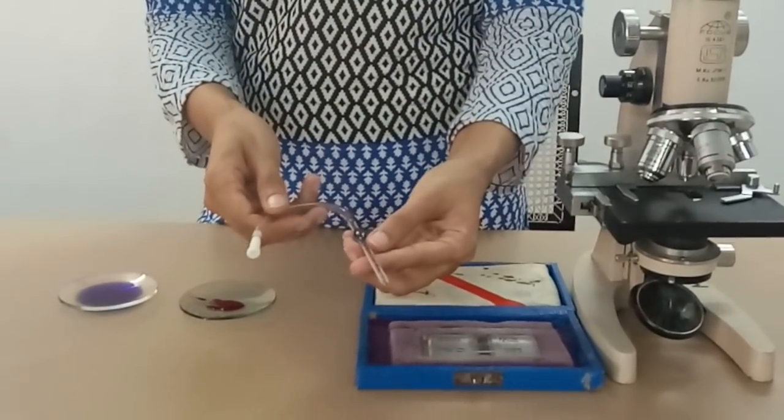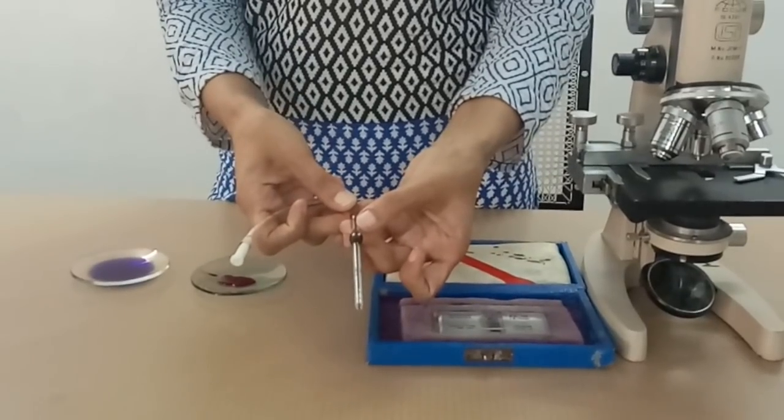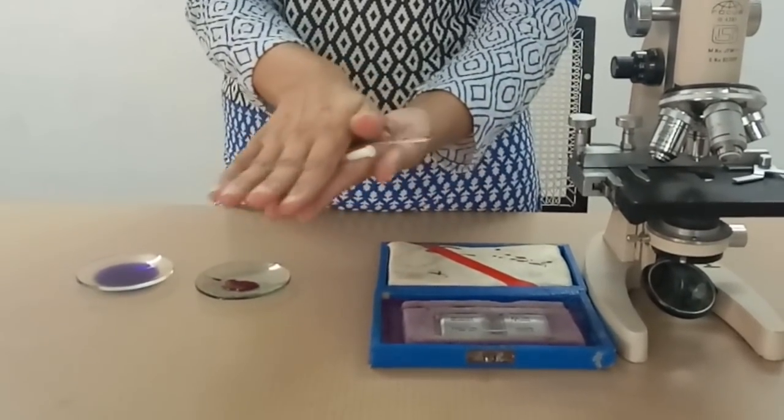Suck the Turk's fluid to the mark 11. Mix the content of the bulb thoroughly for 3 to 4 minutes.